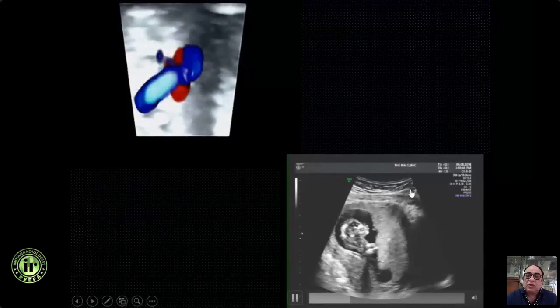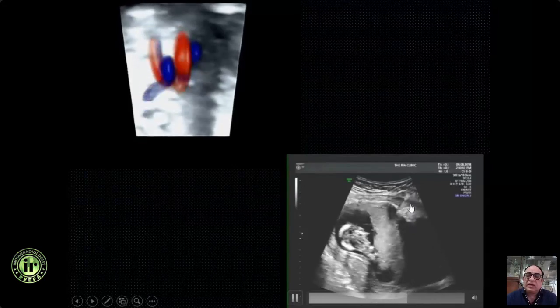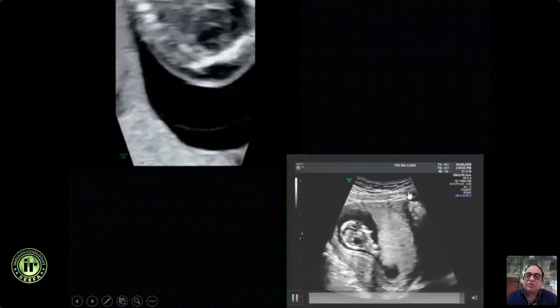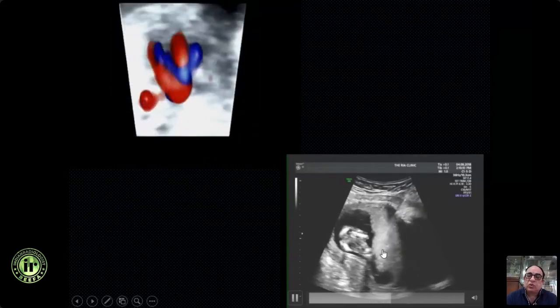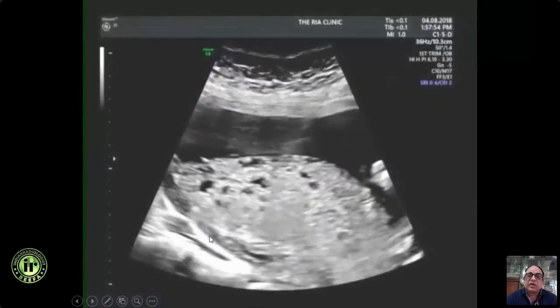As you see here, you go through the skin, subcutaneous tissue, the muscle layer. That's where you may need to talk to the patient, because there's a little bit of pain that the patient gets here when you access the serosa. And once you're in the chorionic villus tissue, then the patient is quite comfortable. So verbal anesthesia is also very, very important.